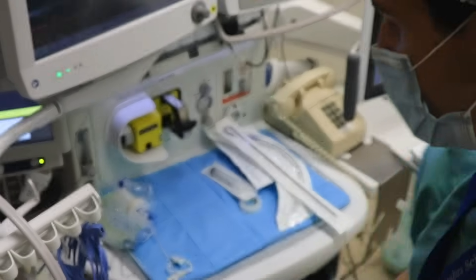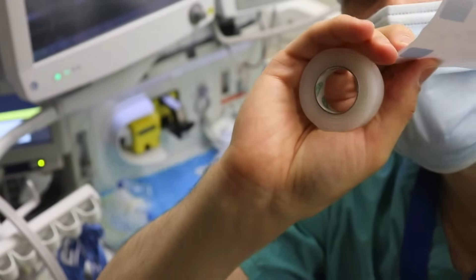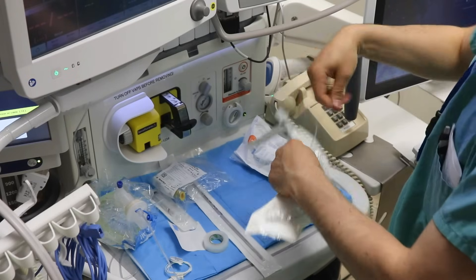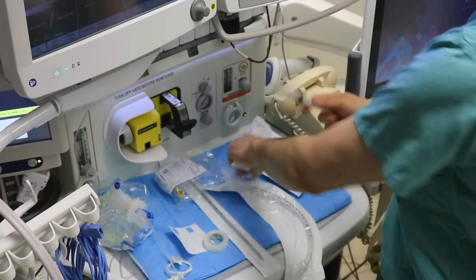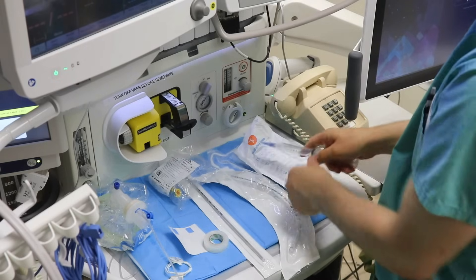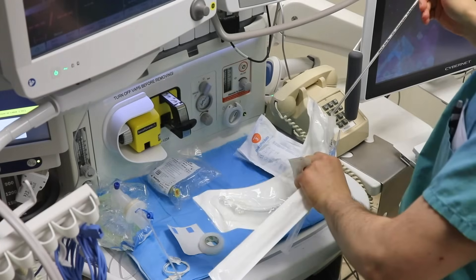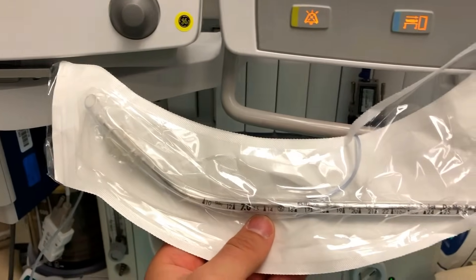An oral airway is essential for both the beginning and end of the case, along with eye tape and tape for the endotracheal tube. It's important to open your endotracheal tube and test the cuff to make sure there aren't any leaks, because a leak from the manufacturer that goes undiscovered until mid-case could be a huge problem. This one's good, so I'll deflate the cuff. Since I like to use a stylet to intubate, I'll go ahead and place it and make the classic hockey stick shape.